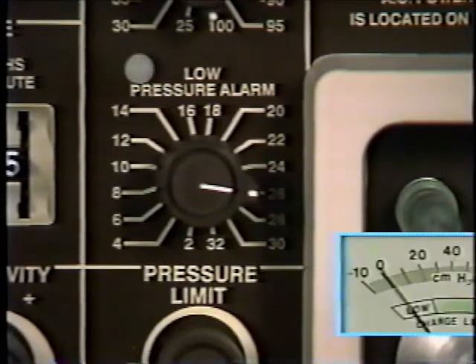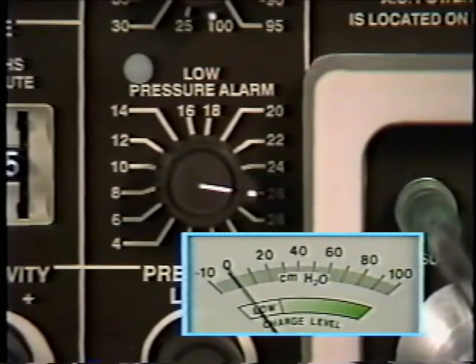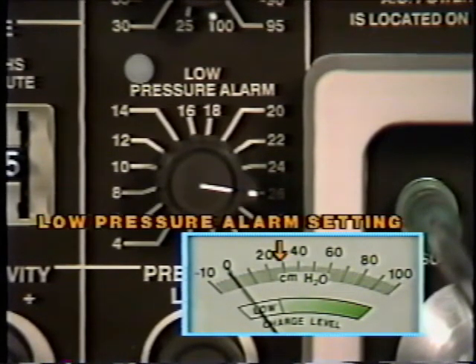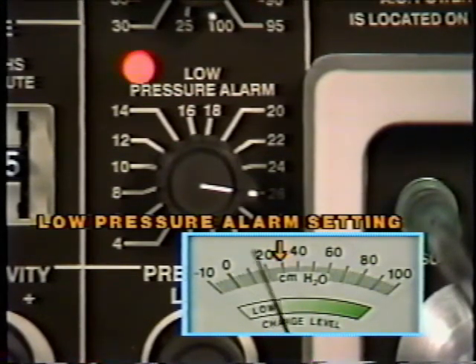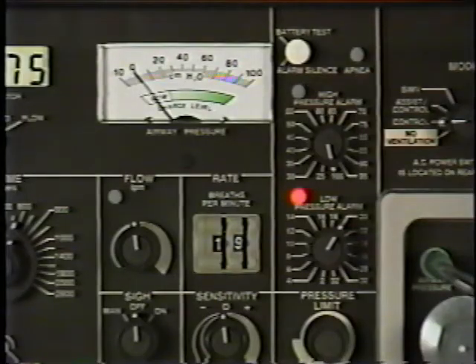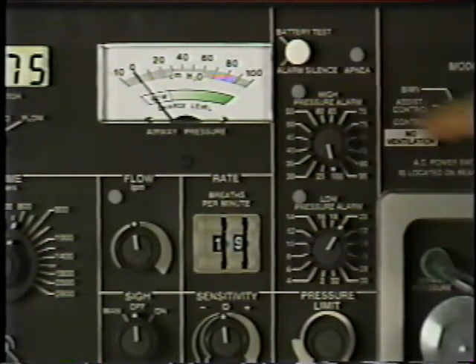In the control or assist control modes of ventilation, if airway pressure remains below the low pressure alarm setting for 15 seconds or 2 breath periods, an audible alarm will sound and the indicator will light. To avoid nuisance low pressure alarming in the SIMV mode, 2 breath periods are required to activate the low pressure alarm. When the alarm condition is corrected, the indicator is latched on until manually reset by the alarm silence button.